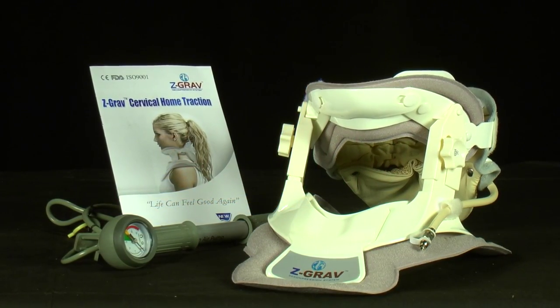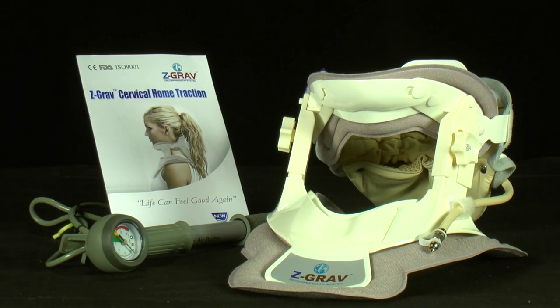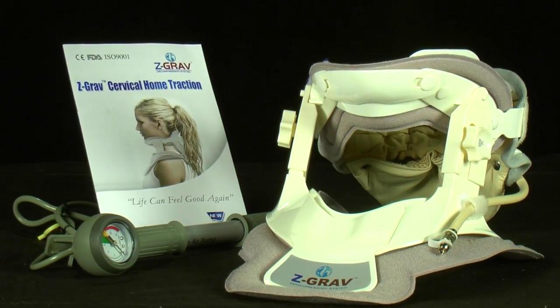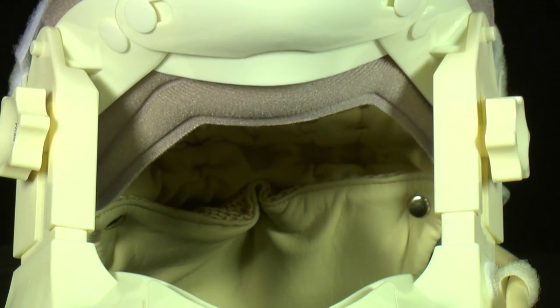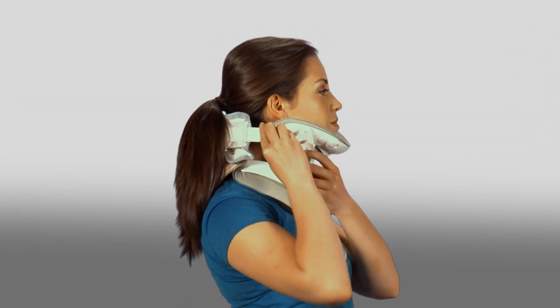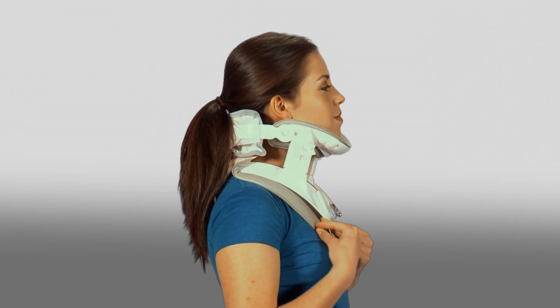The Z-Grav Cervical Collar is an all-natural, non-prescription and non-invasive way for fast neck pain relief in the comfort of your own home. Easy and convenient, the Z-Grav patented BodyJack technology gently lifts the head to temporarily relieve the pressure on sensitive nerve fibers.